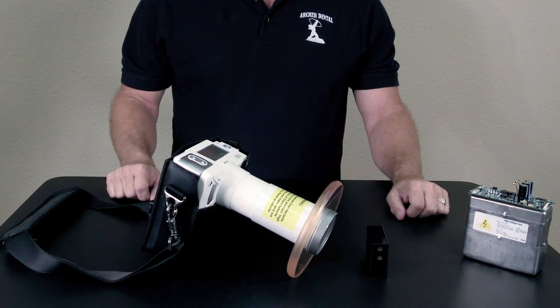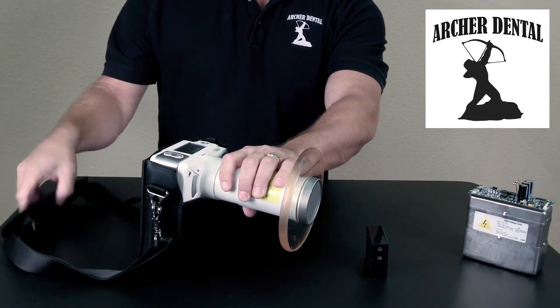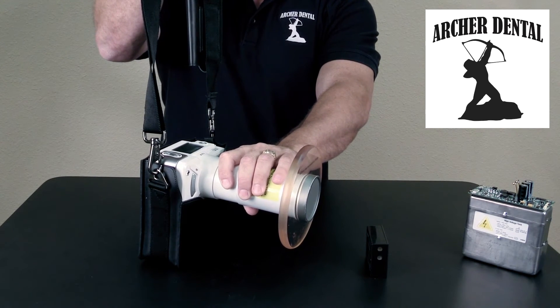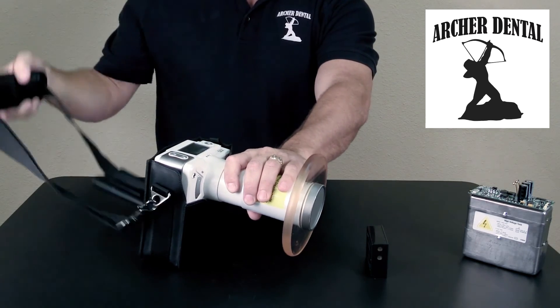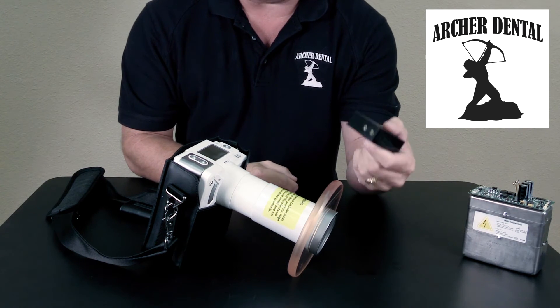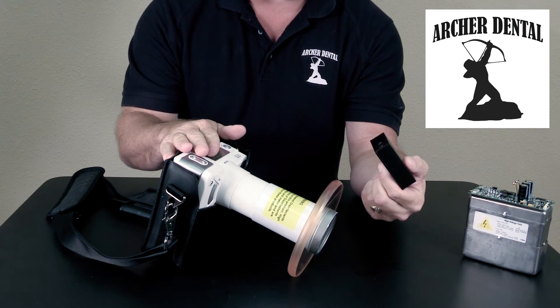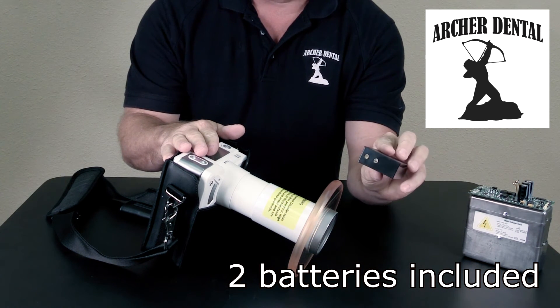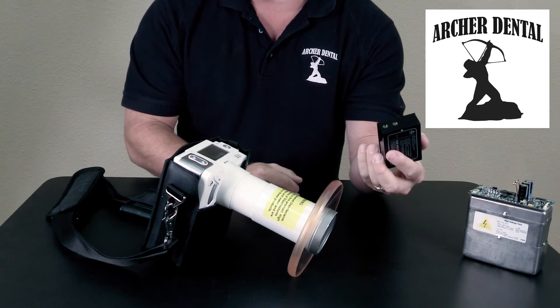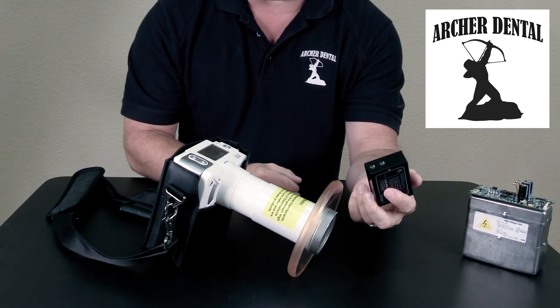A common question is what the difference is between the MaxRay and the Nomad. First, the MaxRay can be worn in a neck holster, which leaves your hands free to help position patients — a major advantage. Second, the battery life on the MaxRay is approximately three times that of a Nomad, and these batteries cost about a third of the price. You'll generally get 300 shots per charge, and so far these batteries have lasted many years without replacement.